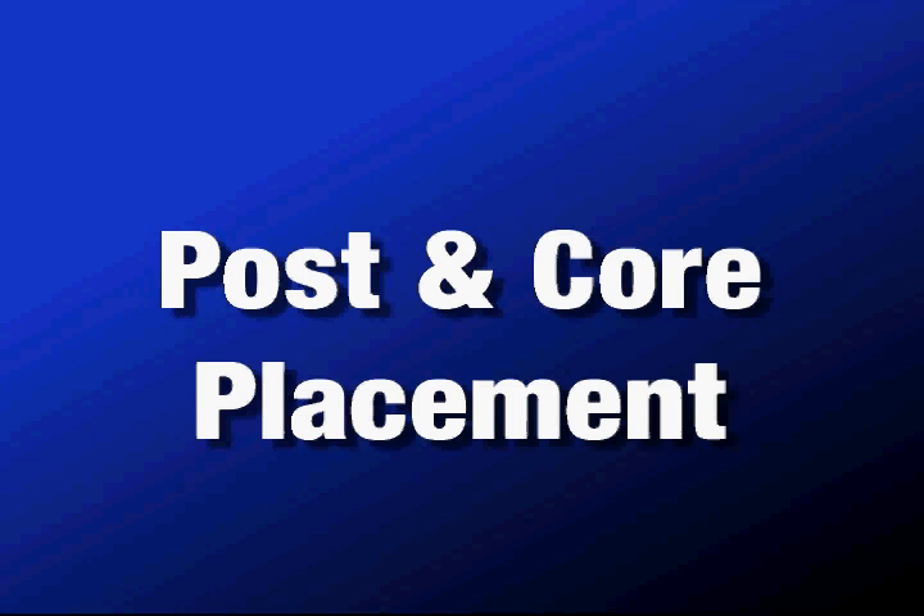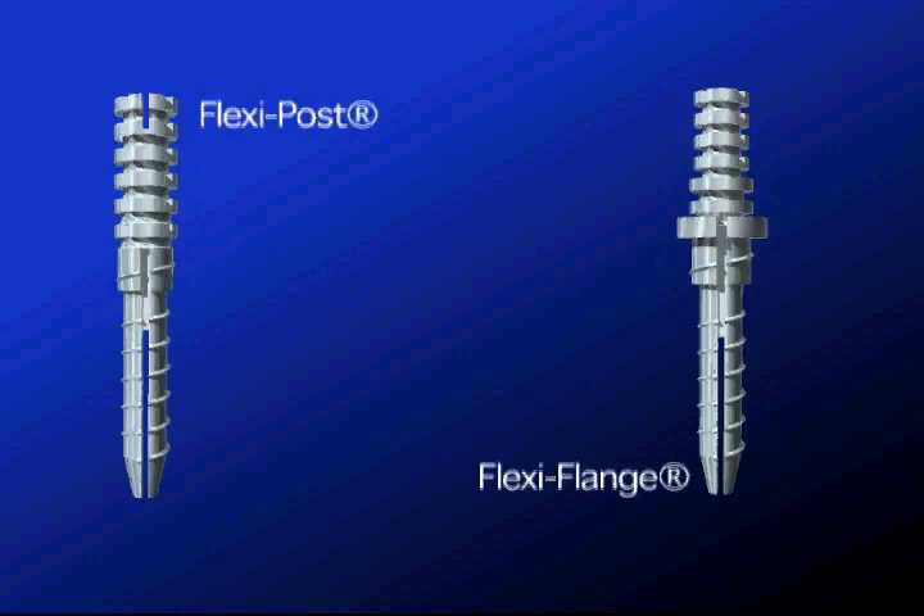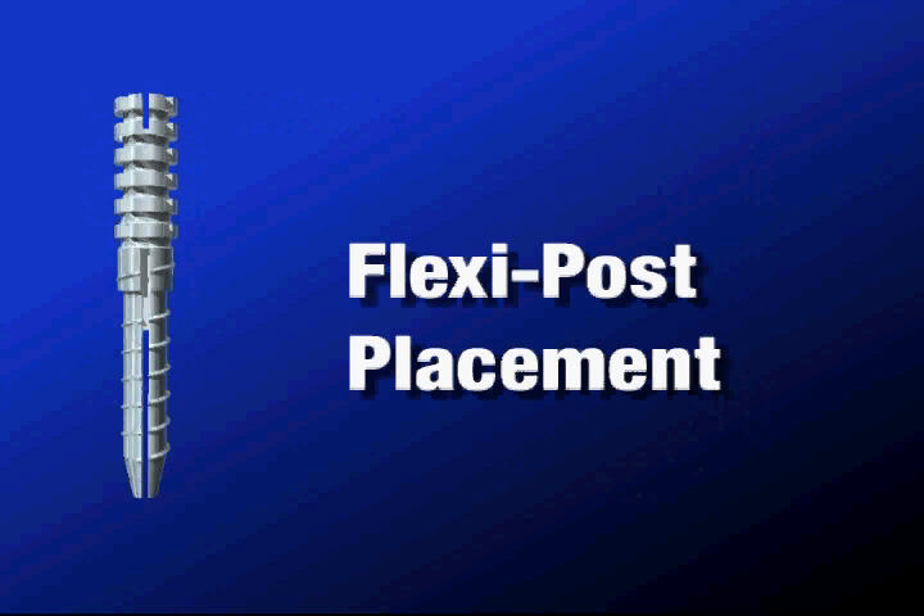Post and core placement. There is so much tooth structure and we never want to remove sound tooth structure. We are using a Flexi Post in this case. The Flexi Post is a split shank, parallel sided threaded post. The split shank design of the Flexi Post makes the post a graduated tap. It closes upon insertion to deliver proven maximum retention with minimal insertional stress.